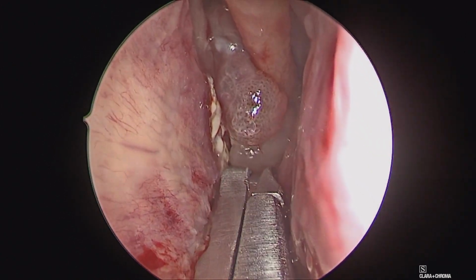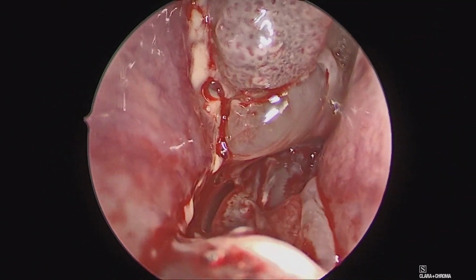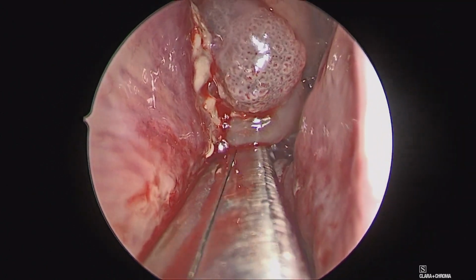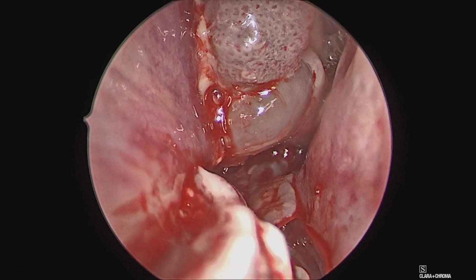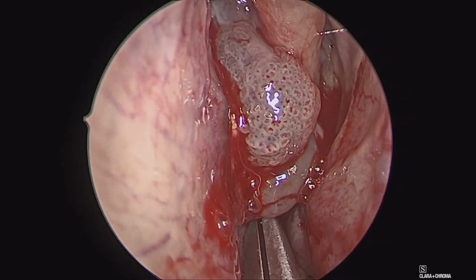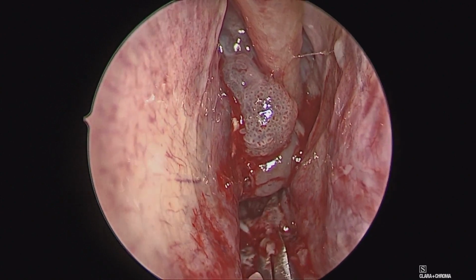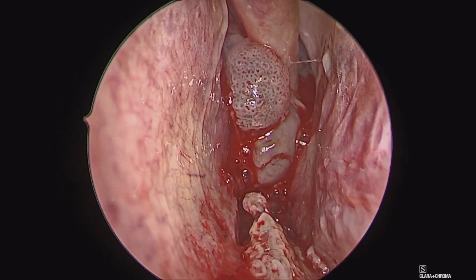Although this patient has had a previous biopsy in clinic demonstrating inverting papilloma, I do like to remove a large portion of the free-hanging tumor at the outset of the case to confirm pathologic diagnosis on frozen section, as well as to clear the nasopharynx to allow for egress of blood during the case to allow better visualization throughout the remaining portion of the tumor dissection.